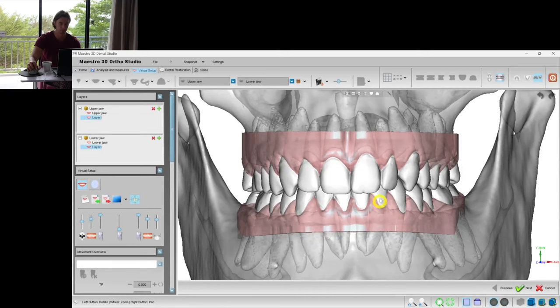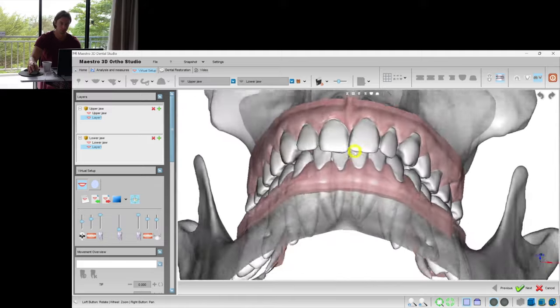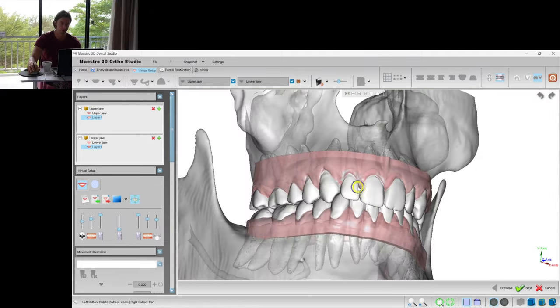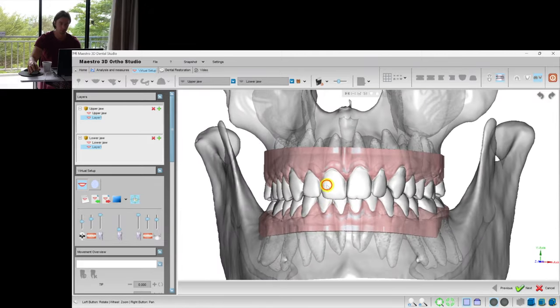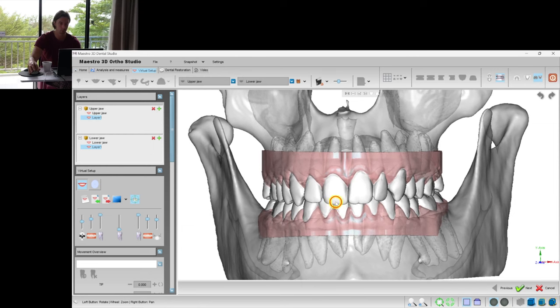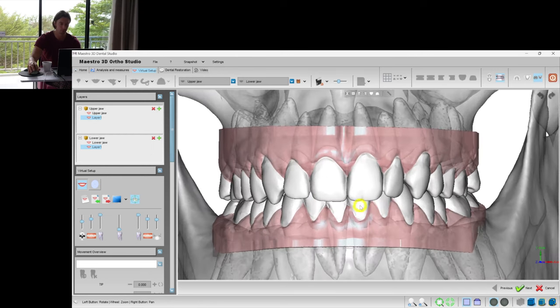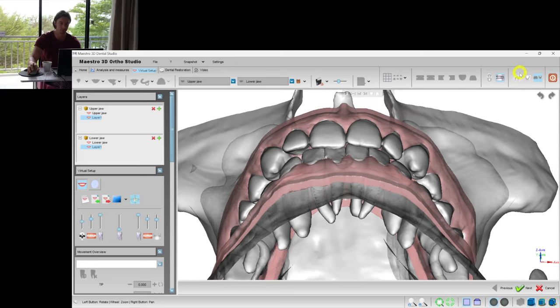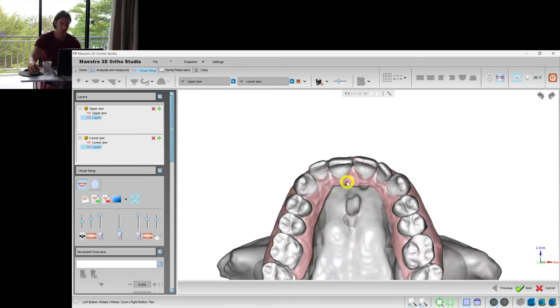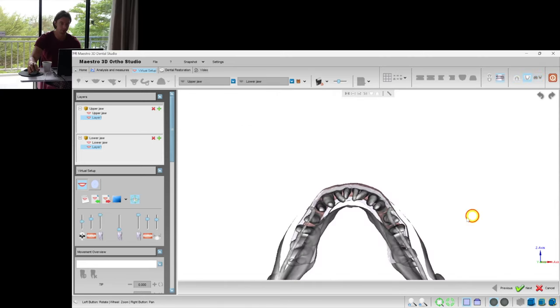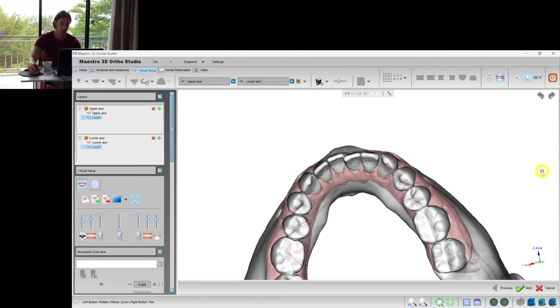This is another episode of me creating a virtual setup in Maestro 3D. Here we have a quite simple case and the patient wants us to fix his frontal teeth position, the crowding.